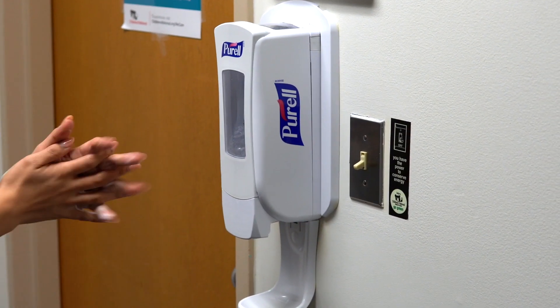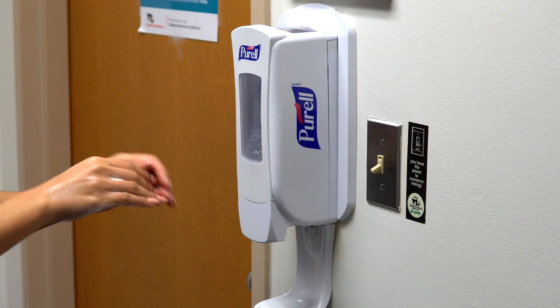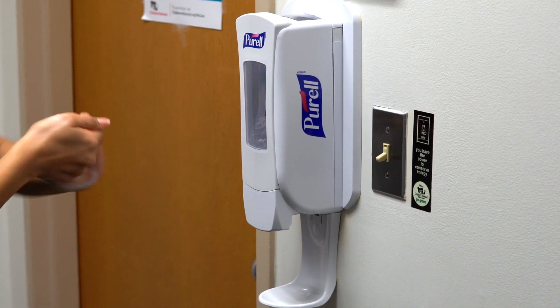Exit the patient room or cohort area. Outside of patient room or cohort area, perform hand hygiene.